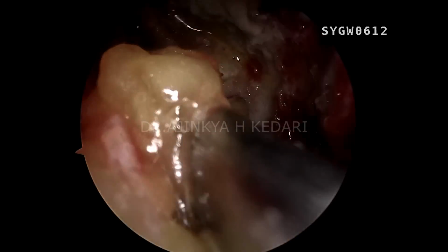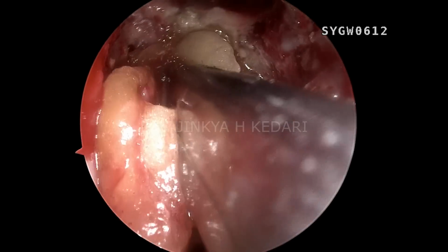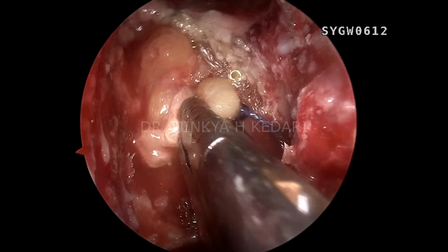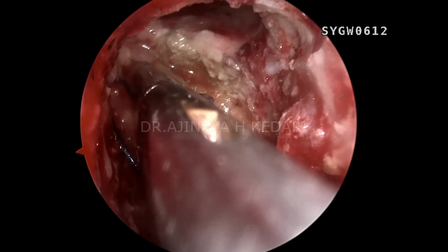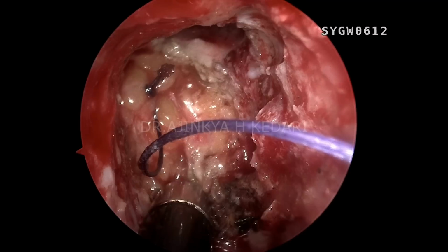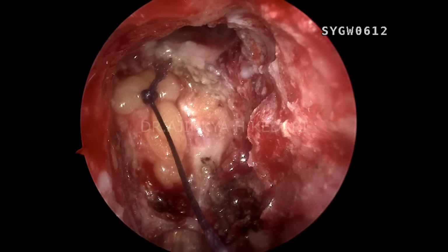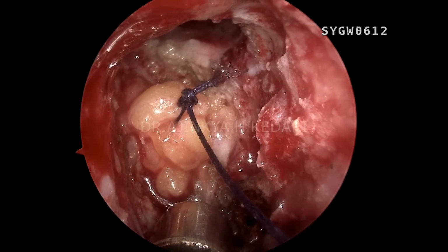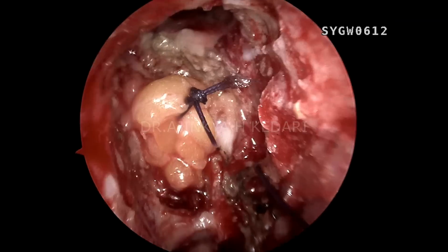Now you can see, after assessing the bony margin, dissecting on the dura, making it fresh, only after that I'll be putting on the fat with a bath plug technique inside. I need to make sure that this patient does not come again on my operation table, and this patient has 100% success rate. So do not fear anything. Just drill on the bone on the posterior wall of the frontal sinus, open up the area, expose the area, assess the defect size, make sure you have completely explored the area. Do not leave any secondary site behind. After having done all this, plug the fat, do a bath plug technique, cut the string.